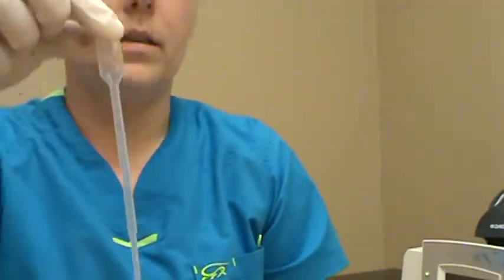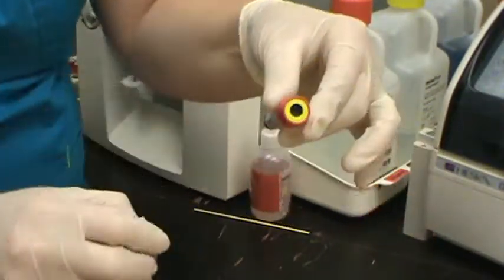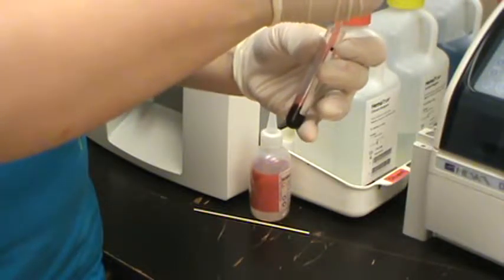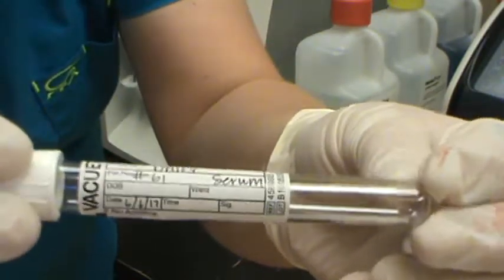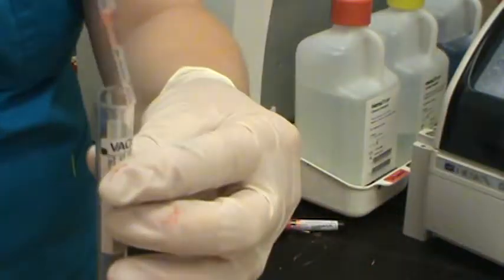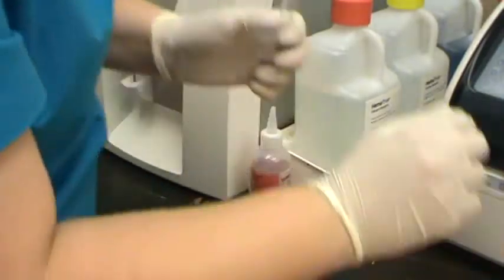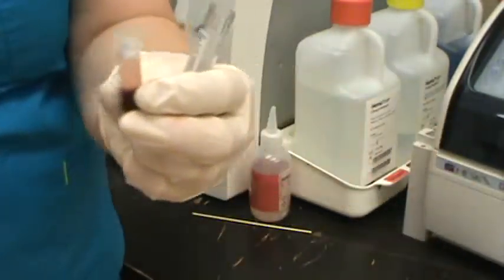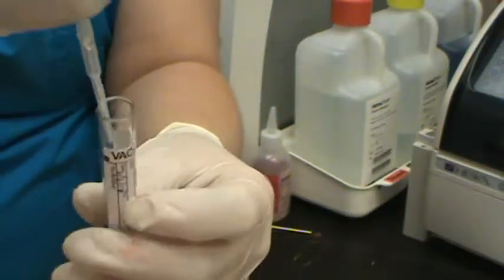Using a clear plastic pipette, we draw off the serum from the serum separator tube, recap that sample, then locate the tube labeled 'serum' and place the serum sample into it. For plasma, we use a different plastic pipette, remove the lid from the lithium heparin tube, draw off the plasma, and transfer it into the tube labeled 'plasma.'